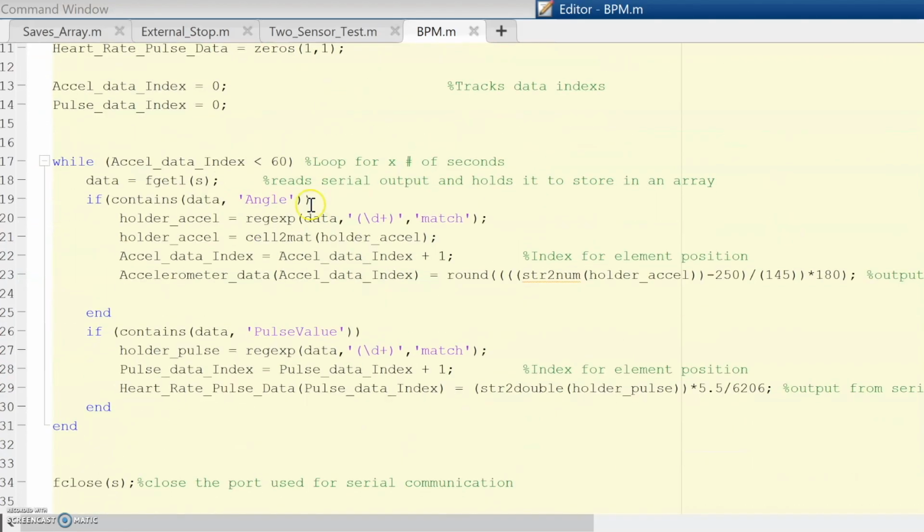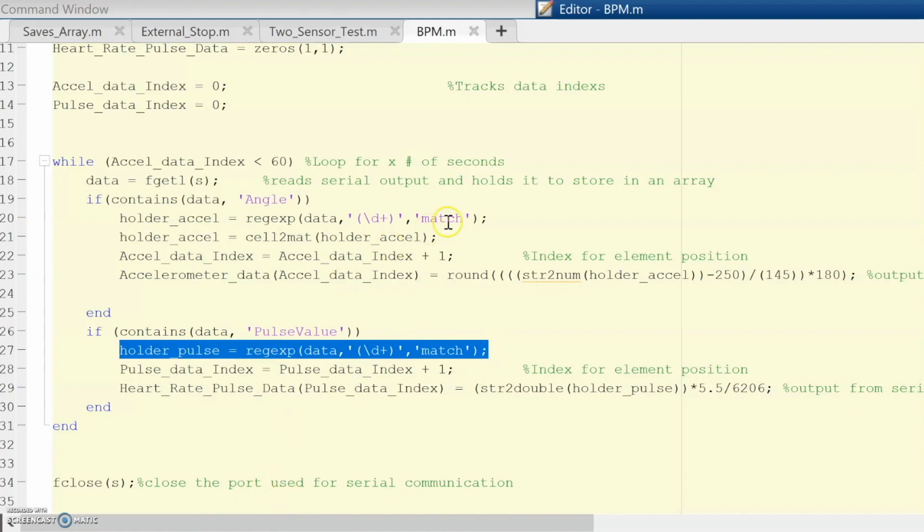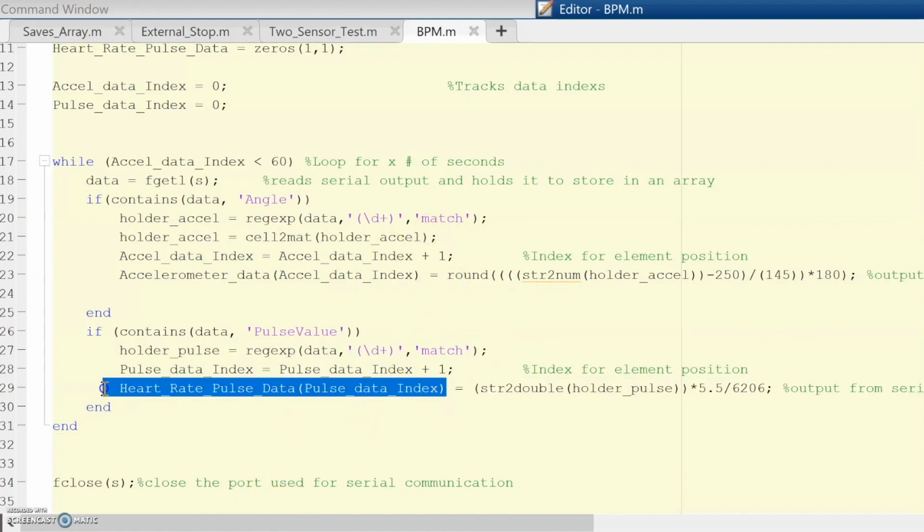Next, we have a loop that runs for a preset period of time. This controls the length of the sleep test and is also used for organization of the two data types. When looping, the code fetches the most recent output line on the serial port and checks which string is included in it. This tag acts as the identifier and is removed before populating the data arrays. These arrays are then sent to be processed.